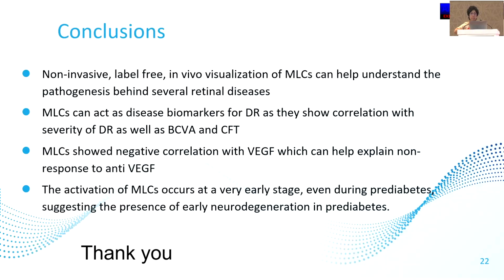So to conclude, the non-invasive, label-free, in vivo visualization of the MLCs can help us understand the pathogenesis behind several retinal diseases, and MLCs can possibly act as disease biomarkers for diabetic retinopathy, as they show excellent correlation with the severity of diabetic retinopathy as well as visual acuity and central foveal thickness. The MLC showed negative correlation with VEGF. This of course needs further exploration, but it can help us explain the non-response that we see in certain patients.